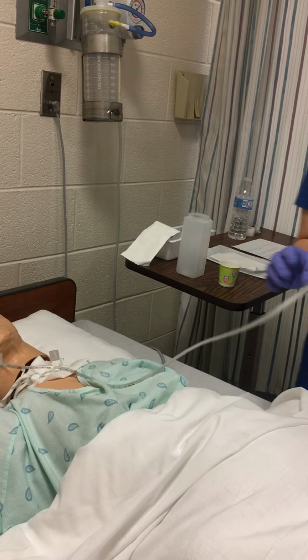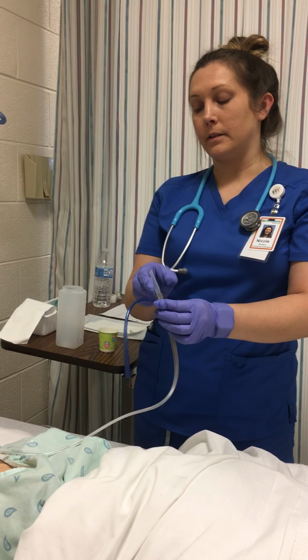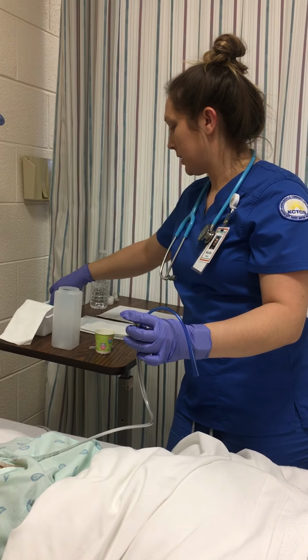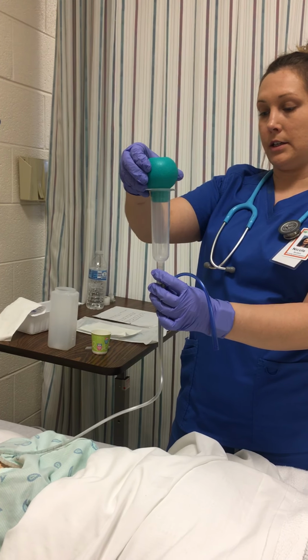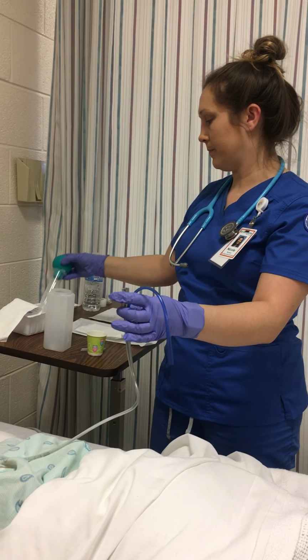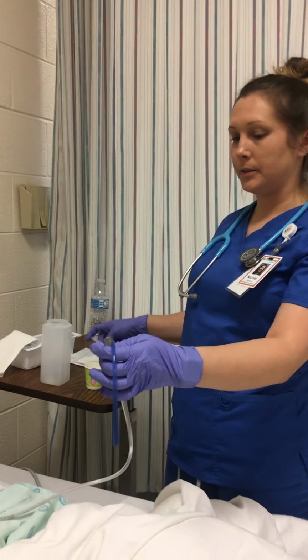Also, you want to check for placement. The doctor should have put an order in for an x-ray, but until that time you want to check placement in regards to gastric secretions and the pH levels. So you're going to want to check that. You're going to take your bulb syringe and take out some gastric solution, and then you're going to put it on a pH indicator, and it should be below 5.5. If so, it is in the right placement.